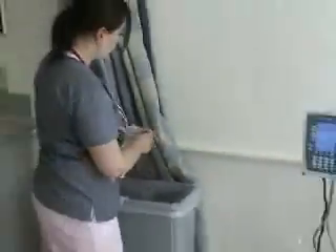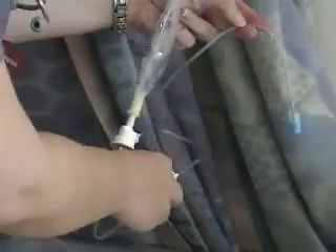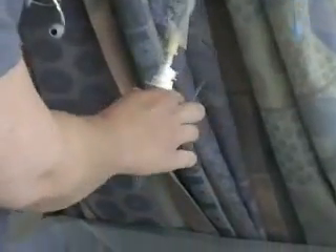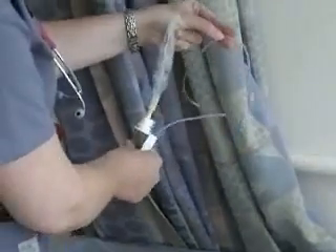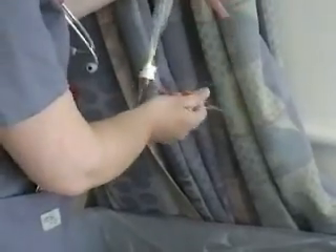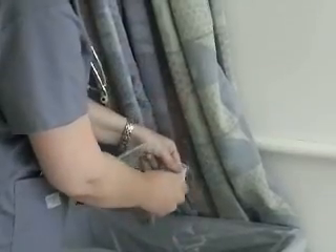Now I want to prime this tubing. I'll hold it over the trash can and open up my line, letting the solution run through until all the air bubbles are out. You might have to put the tubing down a little bit low. Then roll the clamp shut.